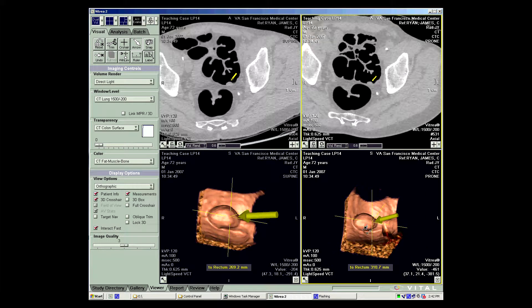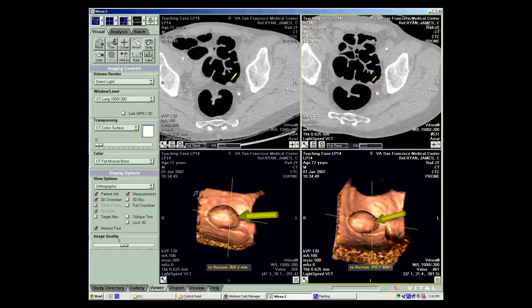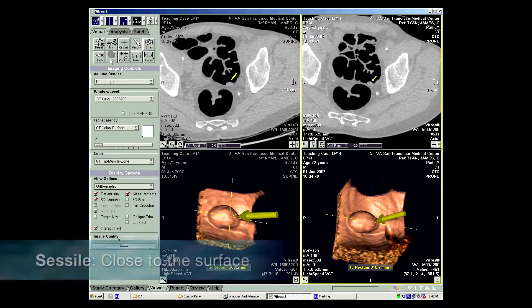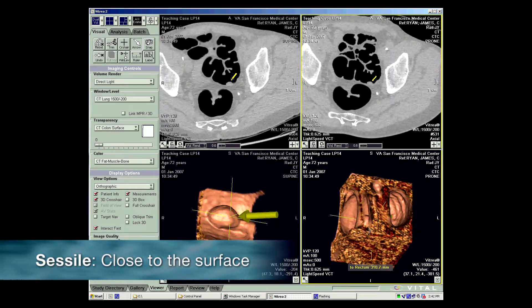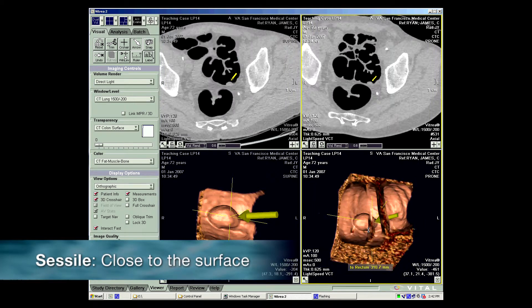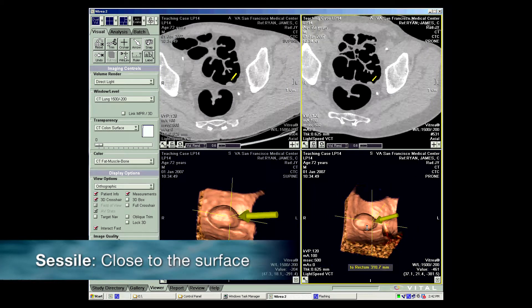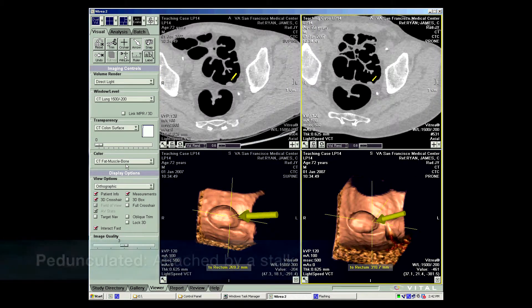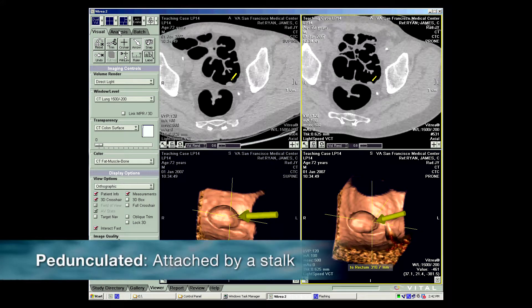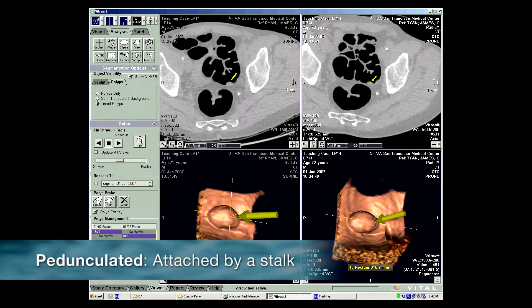This is just demonstrating a lesion that appears more sessile on the supine view, but in the prone view, this is actually a pedunculated polyp.